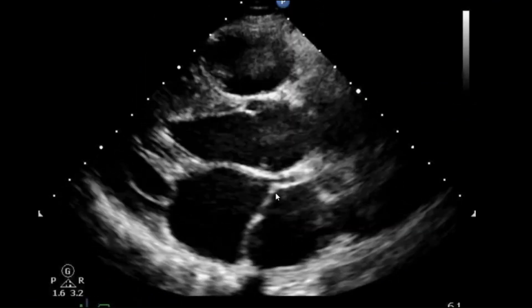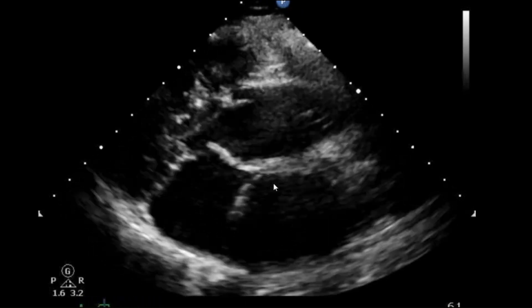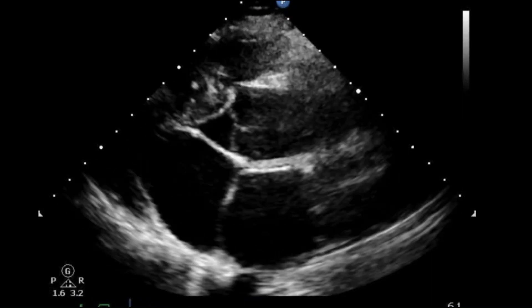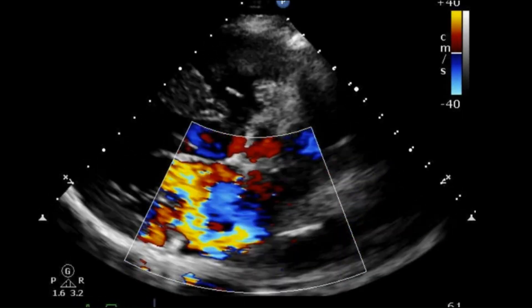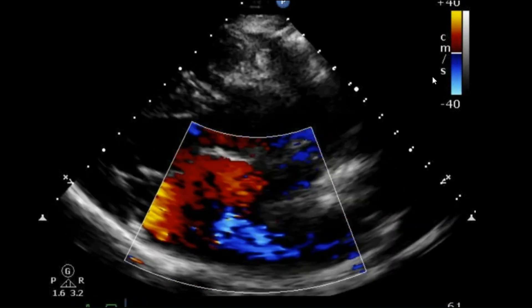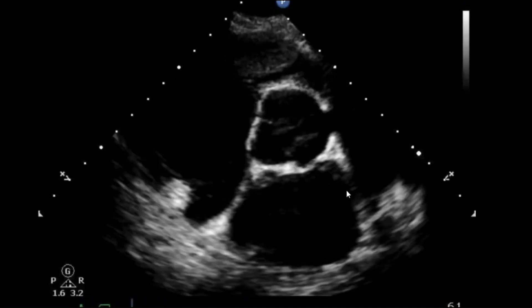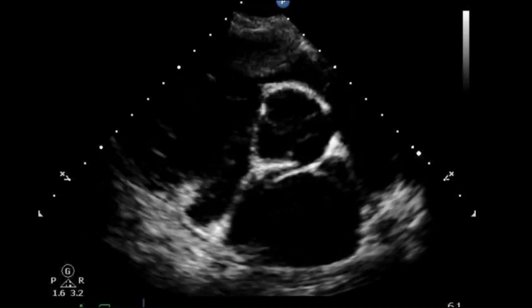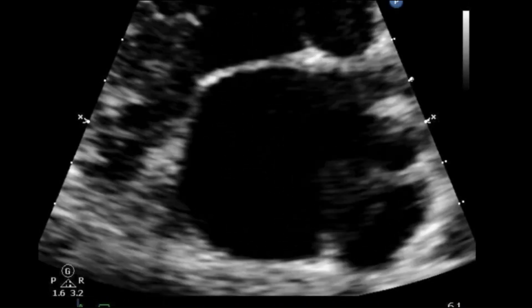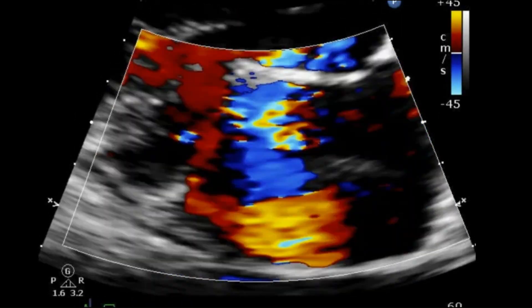In this second case, we can see the membrane a lot more clearly in the parasternal long axis view. This view has been angled to focus on the membrane itself, so it's not quite a classic parasternal long axis. When we look at the colour flow, we can see flow coming up from the inferior element. Again, it's quite low velocity and doesn't look overly restrictive. In short axis we can see the membrane moving up and down very well, and flow coming clearly up along the atrial septum.